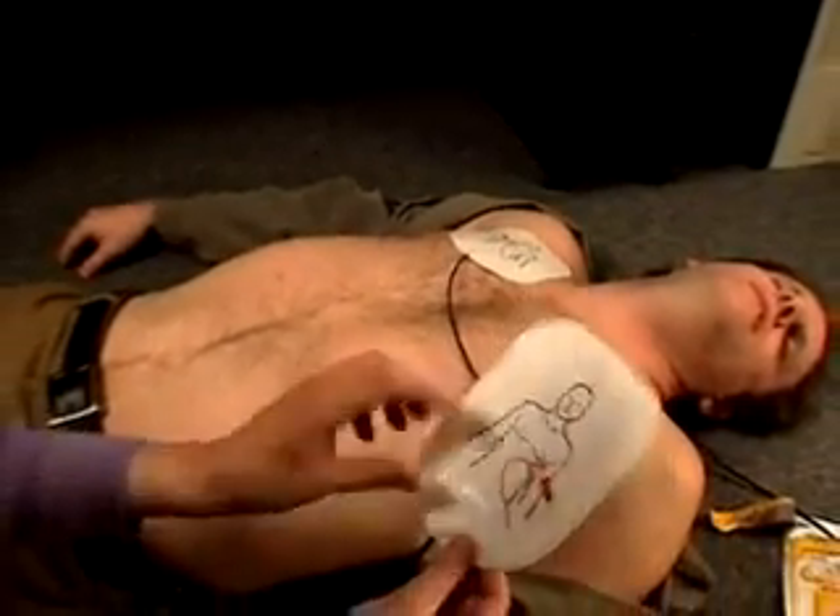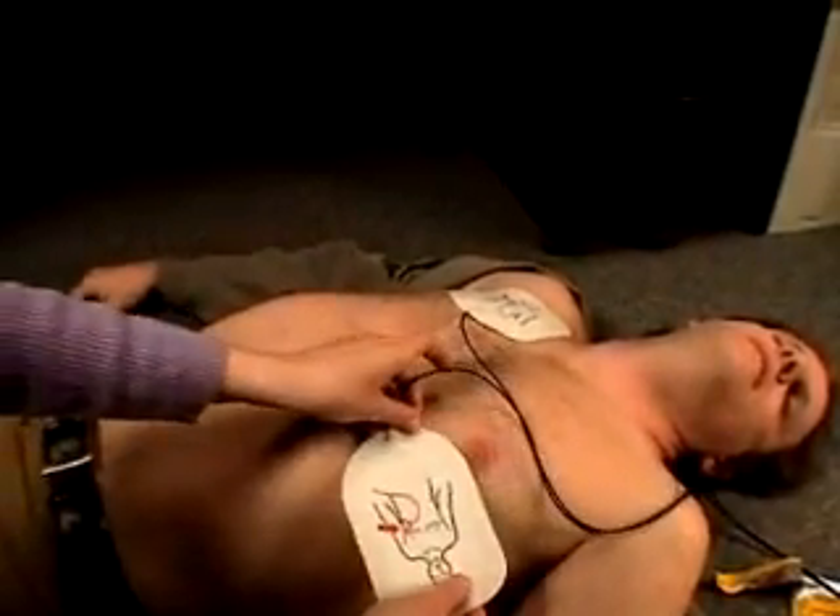Make sure the victim's chest is exposed and dry. If needed, shave the victim's chest hair. Place the pads on the victim's chest according to the diagrams on the pads.